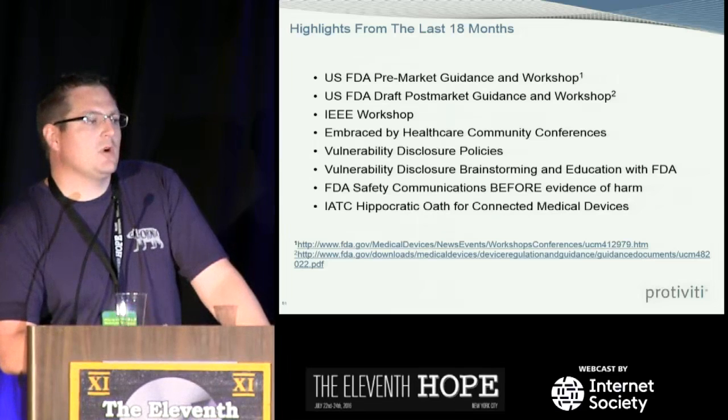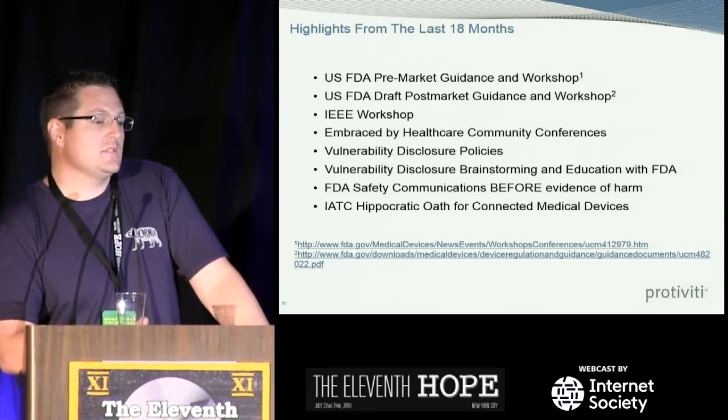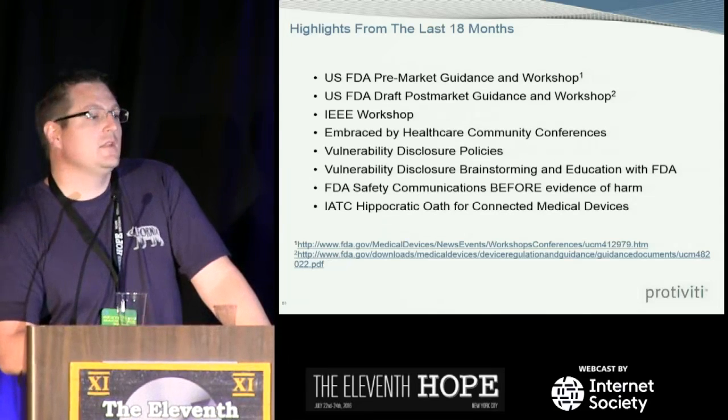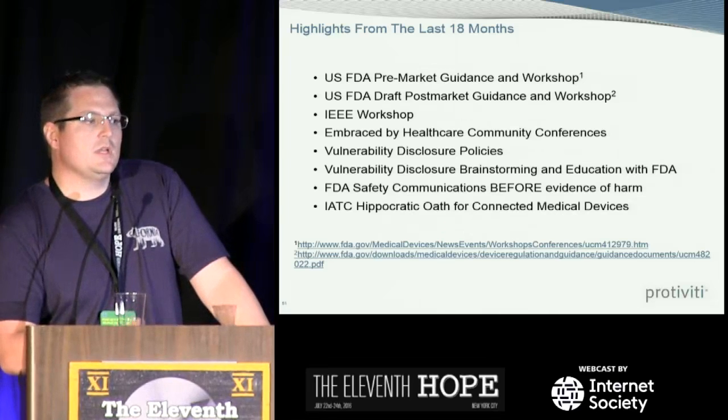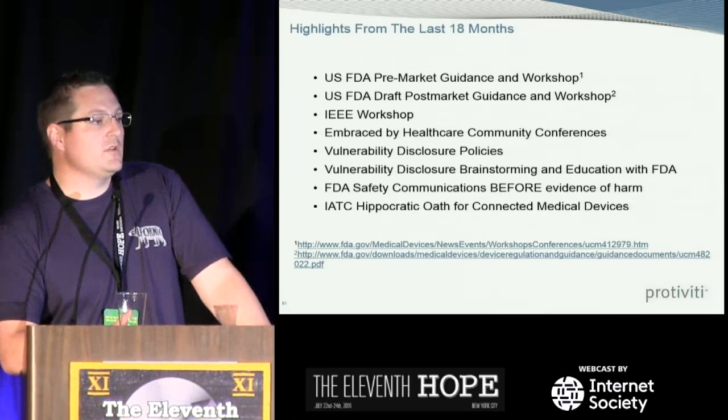So they released pre-market and post-market draft guidance. The draft guidance from a security researcher perspective is awesome. It's awesome for a healthcare provider too. It includes language that they have to have a coordinated vulnerability disclosure program and set some time limits around that. So that's a huge win, and that's a government agency working in collaboration even with security researchers.